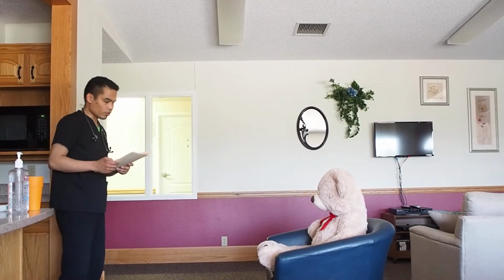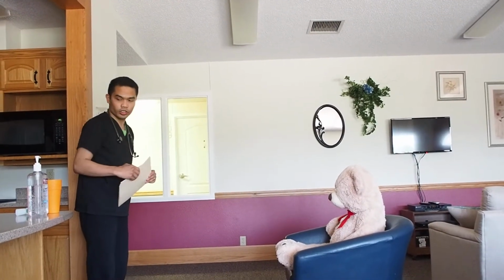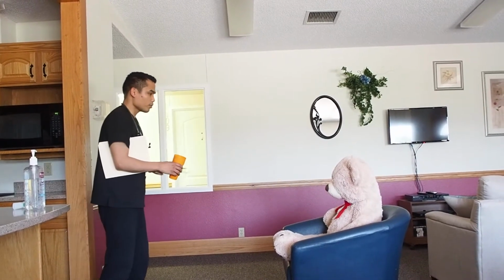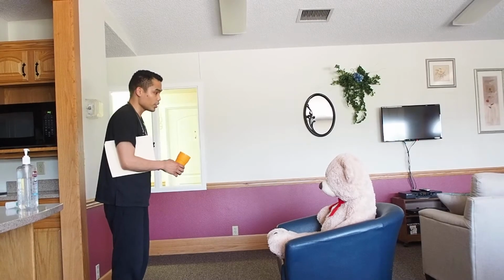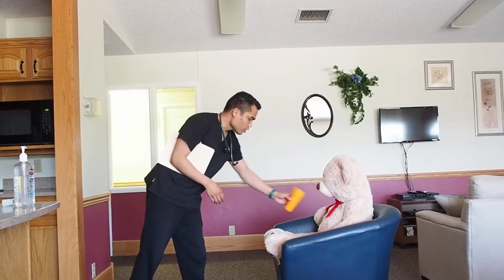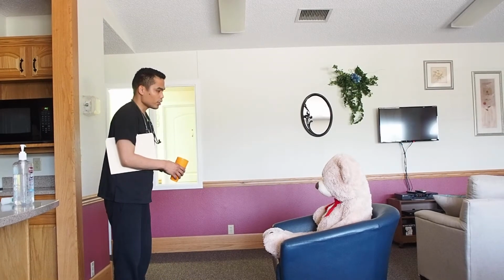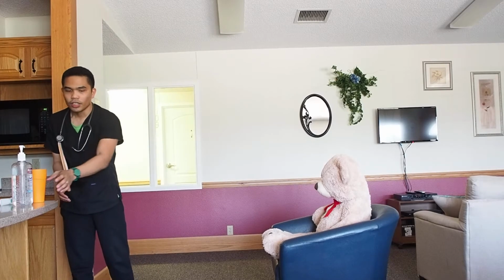So I'll just have to let you rinse your mouth, by the way, because this medication is a corticosteroid. The side effects of this one are a change in your voice quality or oral thrush. So here is a glass of water. Please rinse your mouth, gargle it, and spit all that water out. And then can you inhale deep again and cough for me at the same time?